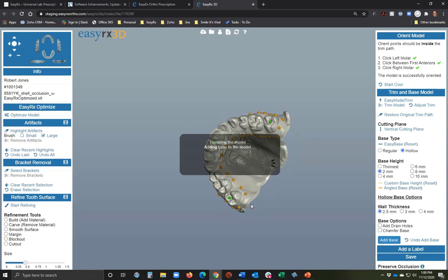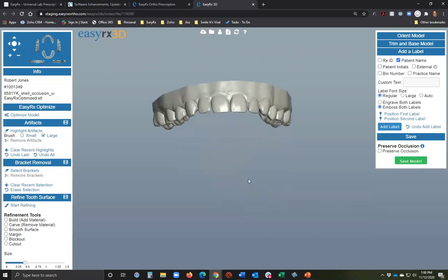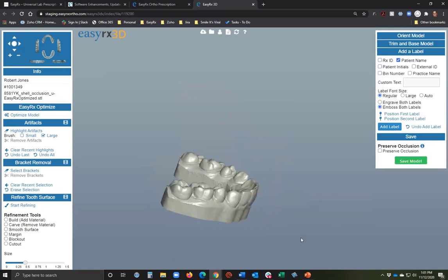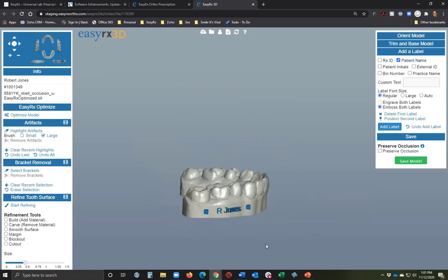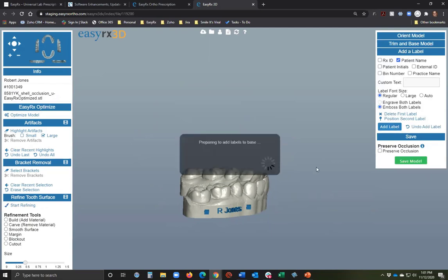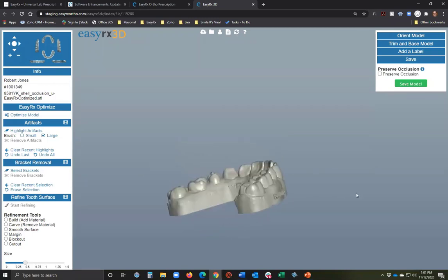After adjusting the trim points higher, I click 'Add Base' and in one step the model is trimmed and the base is added. EasyRx 3D does not move teeth — it's not a competitor to 3Shape or Exocad — but it does remove brackets from teeth, which I'll show in a moment. There's a nice horseshoe hollow model. You can also add a label — either engraved or embossed.